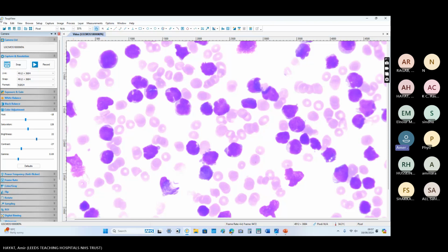So you cannot say whether this is acute myeloid leukemia or acute lymphoblastic leukemia on morphology. You can only say probably acute leukemia. The lineage differentiation is always on the flow. The flow will tell you whether this is myeloid or B-ALL or T-ALL, whatever the flow cytometry is. You cannot do bone marrow biopsy in this patient. He has a bleed, he is confused and unconscious with low GCS. So it's very difficult to do an invasive procedure in a patient like this.